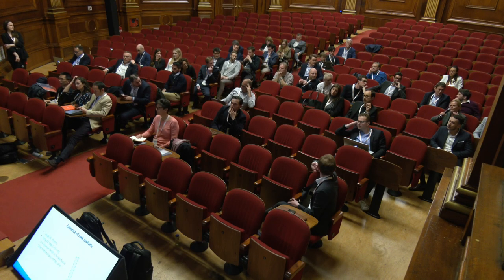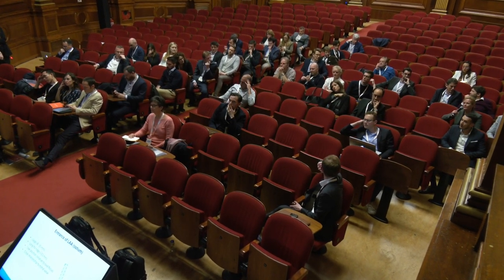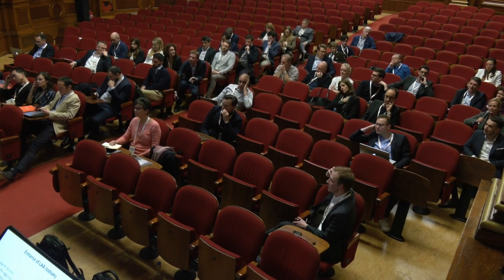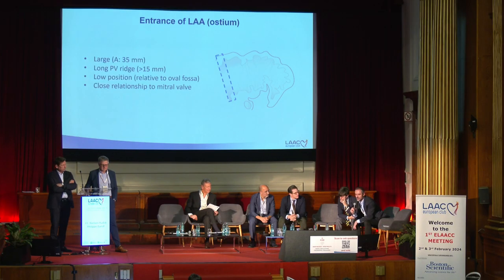A side lobe originating, so to say, from the ostium level would be a factor that complicates a procedure for me. Yeah. And also the eccentricity. I mean, sometimes you have two proximal lobes, and then you have this eccentric shape, because it's just the sum of these two lobes. So extreme eccentricity, I think, would also be something important, because at the end, you don't want to just leave the lobes open, you want to close the ostium, so you're using special devices for those.